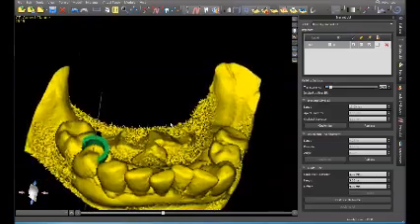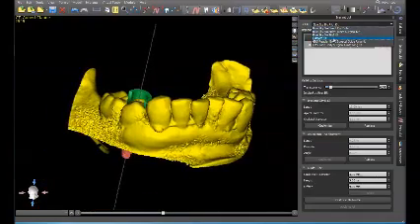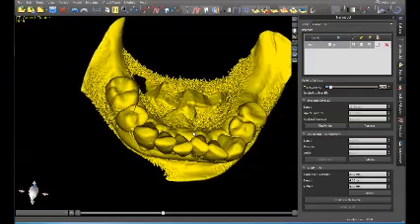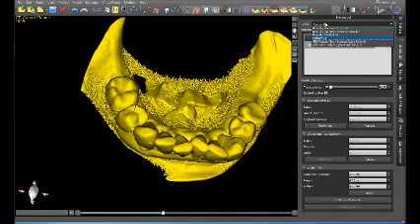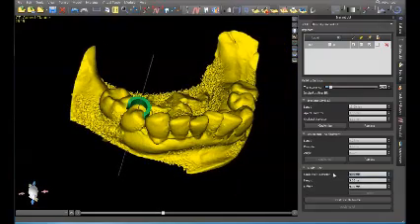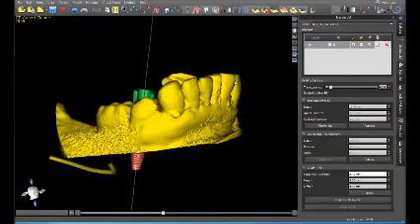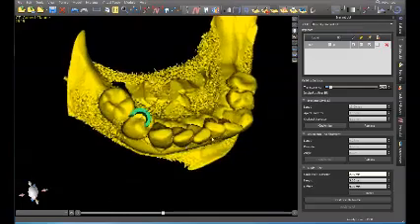So at this point, if you're going to use guide sleeves, you go ahead and move on to the next section. If you want to use a custom kit, the only problem with using custom kits is you'll lose your depth drill. So I prefer pilot drill kits. Or you could stay in this and change this number to a 2.1 and still get the depth drill guide. So, I guess I'll just show it to you like this.